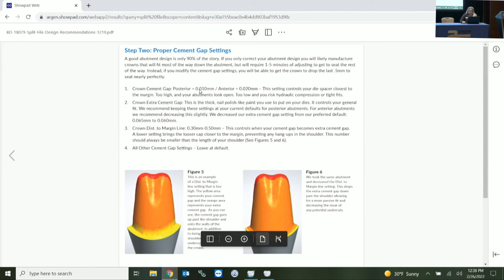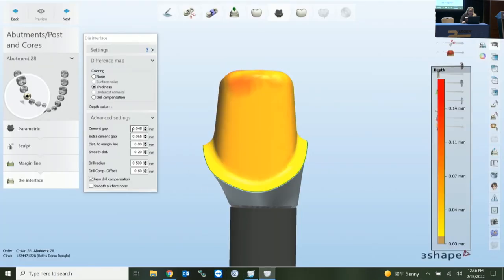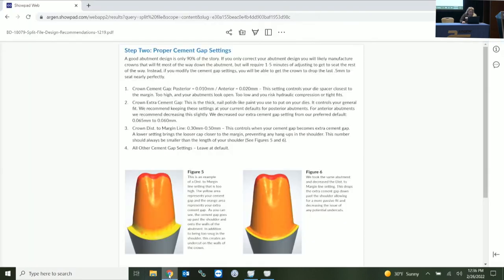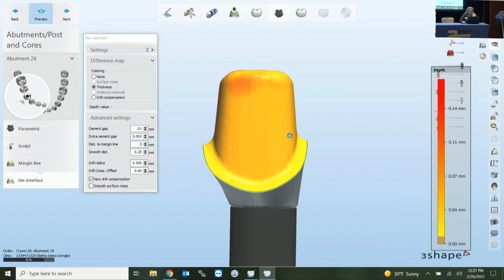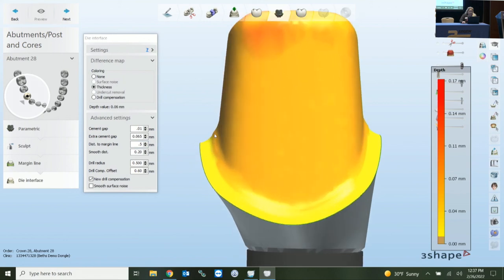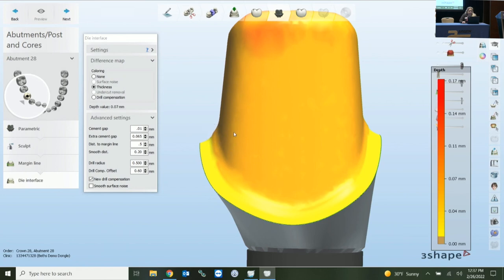The document breaks settings up into posterior and anterior, and breaks down extra cement gap and distance to margin. Back in the design, cement gap is 0.01 and extra cement gap is 0.065 — that's a good setting. Previewing, you can see it drops the extra cement gap to allow more room in those critical areas. If your crown is not seating and is raised about half a millimeter, most of the time it has to do specifically with the shoulder area.